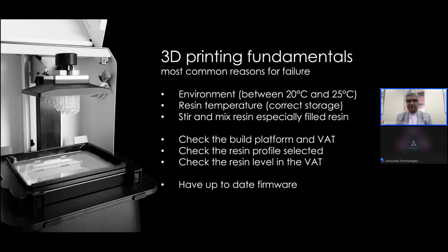You also want to be careful about not having too much resin in the vat, because if you exceed the max line and the resin spills over out of the vat, that's not a good thing for your printer either. Make sure as well that you have up-to-date firmware. Sometimes companies are constantly improving things.